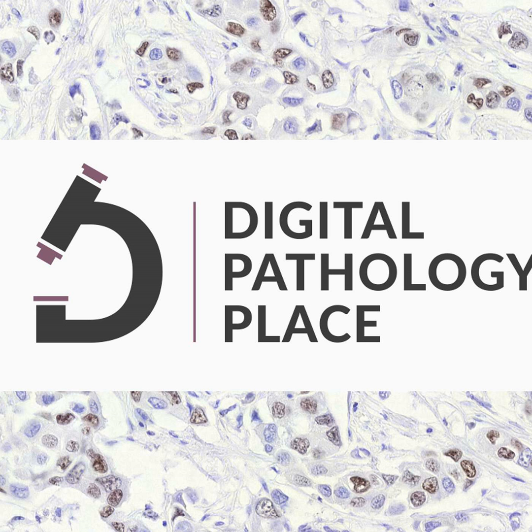And this automated quantification of biomarker expression on whole slide images is the first application of digital pathology, the first application of image analysis that actually made it into the diagnostic space. It used to be based on hard-coded or handcrafted features. Now it's AI-based, but it has been there for quite a while.